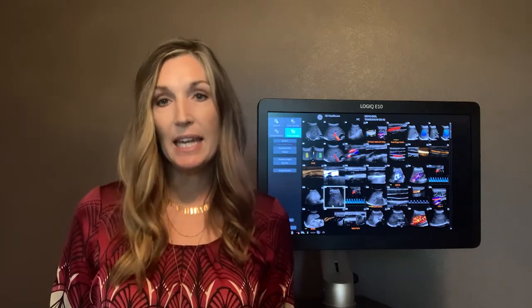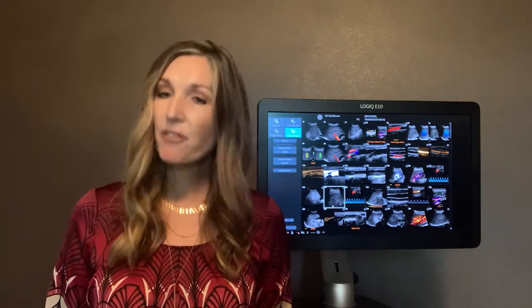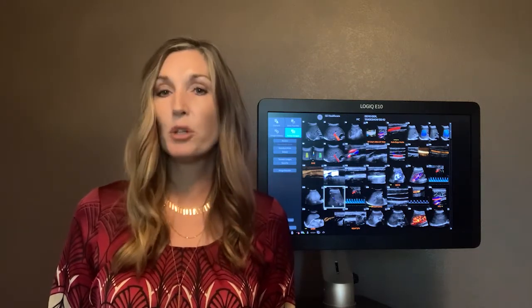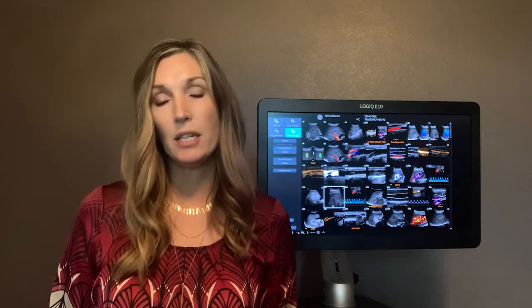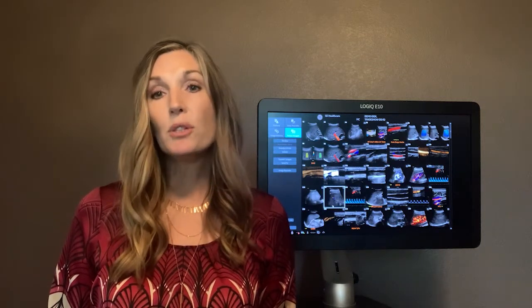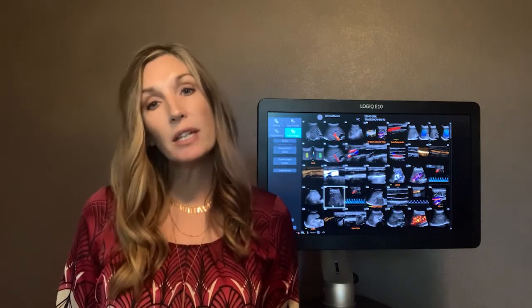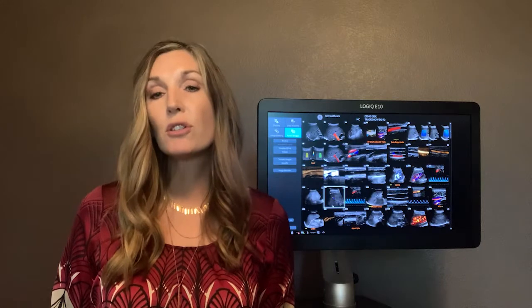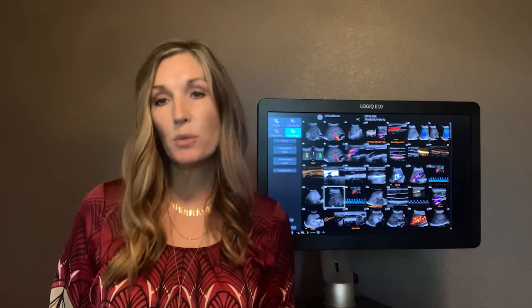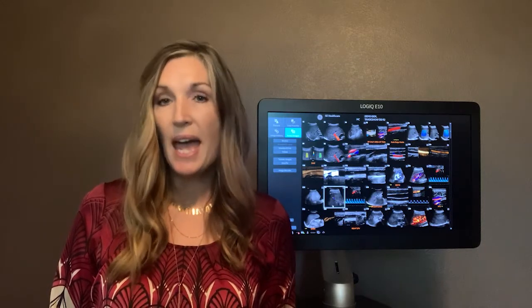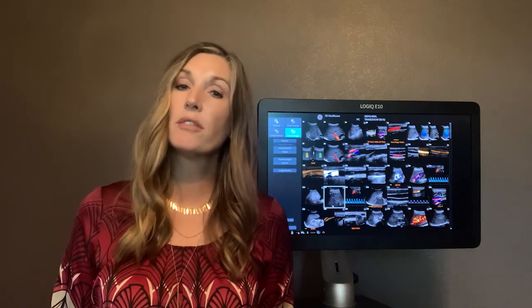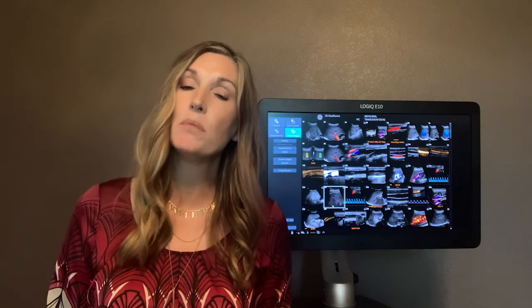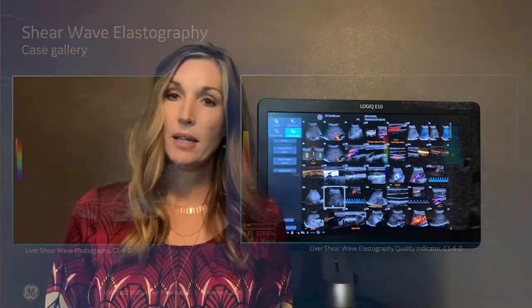The Logic E10 helps you make a difference in the lives of your patients with confident diagnosis using C-Sound architecture that combines with versatile XD-Clear transducers and the C-Sound image former to deliver exceptional penetration and image quality.